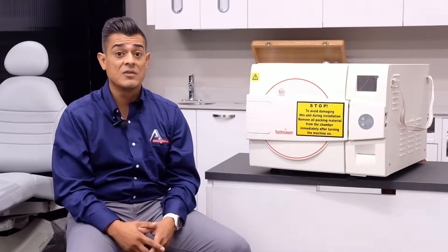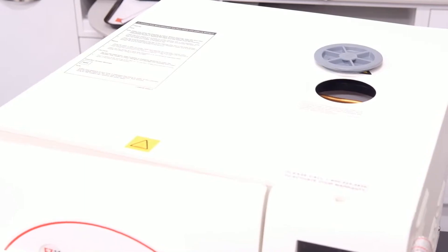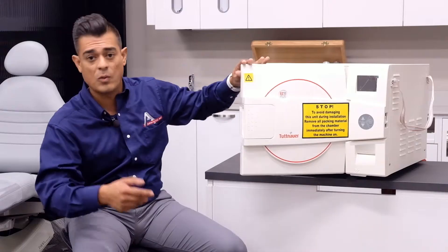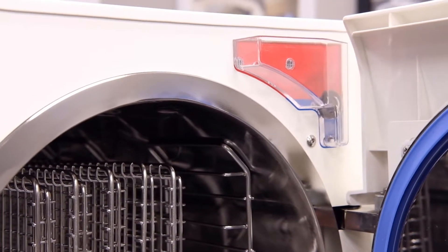The EZ Fill water reservoir is really nice and conveniently located in two places. You can find it at the top of the EZ11 Plus, or if you open the door, you can also pour your distilled water in at the front.